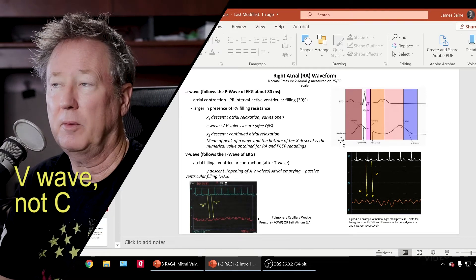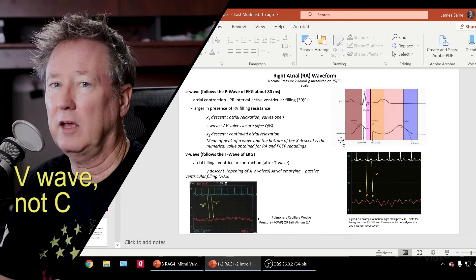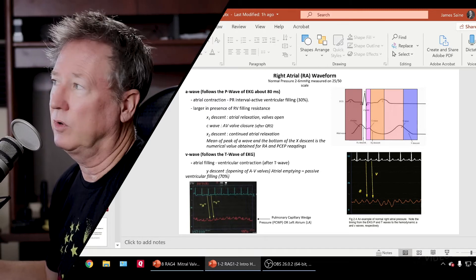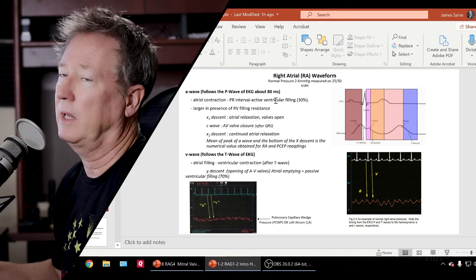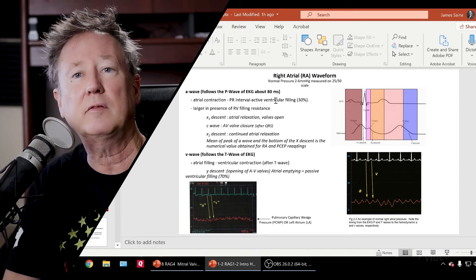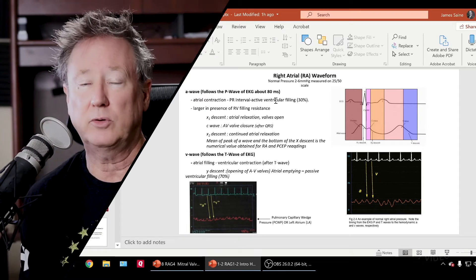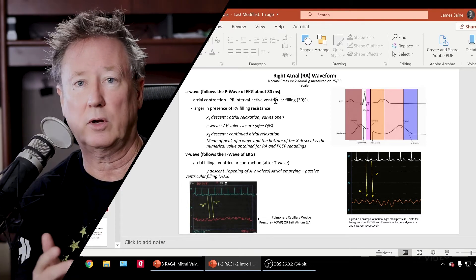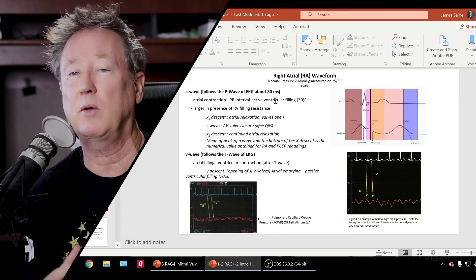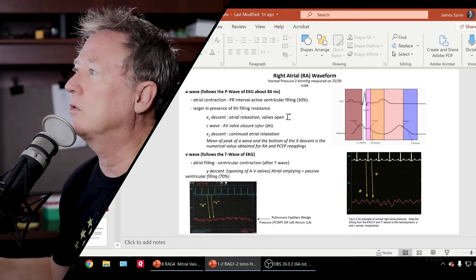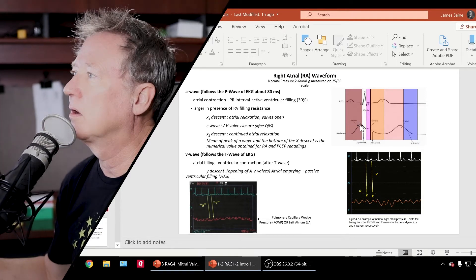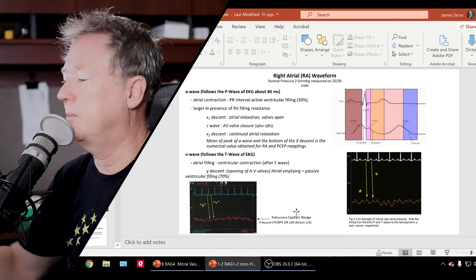You can't just look at the pressure alone — you could make a pretty good guess, but if the heart rate is fast, you could be wrong. The A wave, when you're in the right atrium, follows the P wave by about 80 milliseconds. The A wave represents atrial contraction and will always follow the P wave — because the P wave on the EKG is atrial contraction, and we can record the electrical activity quicker. So if you find the P wave and come straight down, the next hump of the waveform is the A wave.